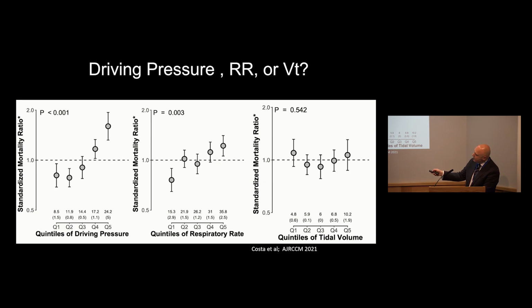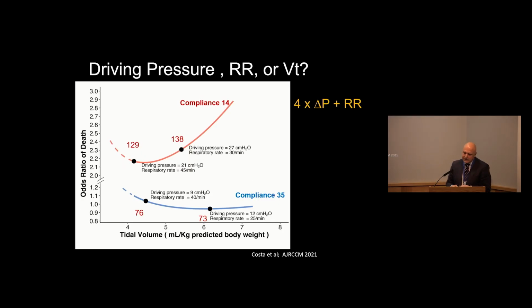So now the question we've got, driving pressure and respiratory rate. And do you remember earlier on we were saying, how do you decide whether to increase driving pressure and decrease the rate, or vice versa? Now, this is an interesting idea, is the idea that this is a population level, and this is one step forward towards mechanical power, that essentially you can take patients, let's say, patient with low compliance. Here you've got driving pressure of 21. I know this is extreme cases, and a respiratory rate of 45. You said I'll never go above 30. They did. It's not great, but just this for mathematical purposes.